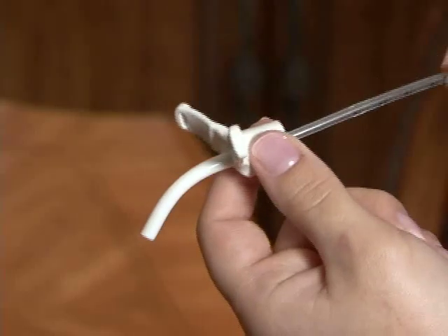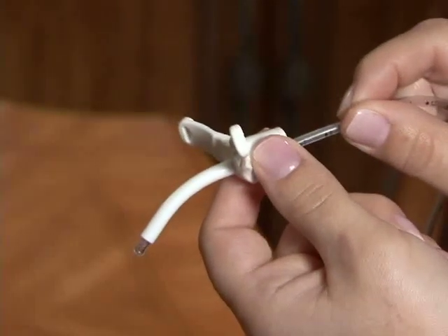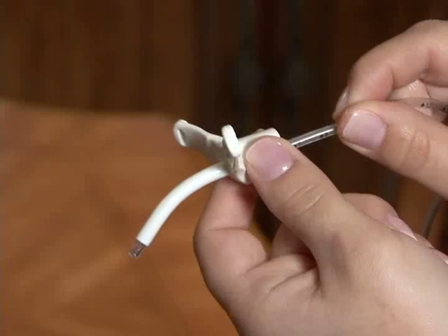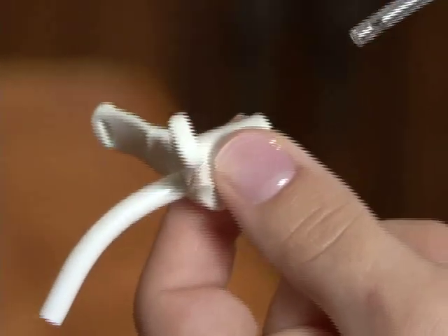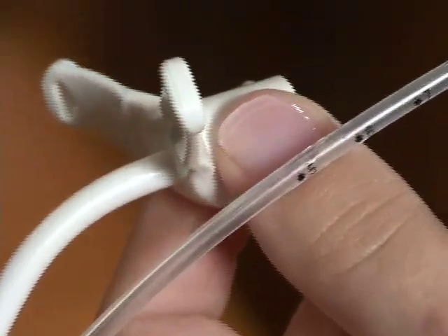The proper way to suction involves knowing how far down you need to insert the suction catheter. The easiest and safest way to do this is to measure your catheter tip against an extra trach tube that is the same size as your child's. The tip of the suction catheter should go to the end of the trach tube or just slightly past it. A lot of catheters have numbers on them, which will easily allow you to know where to stop.